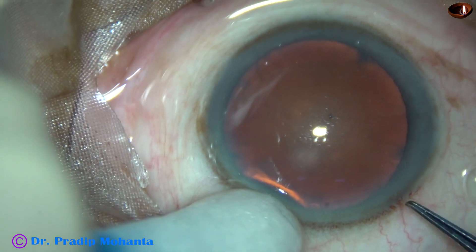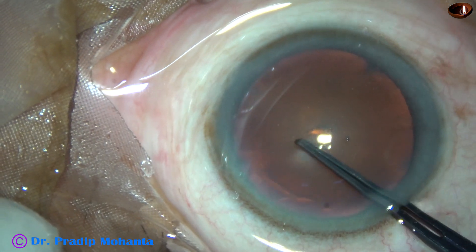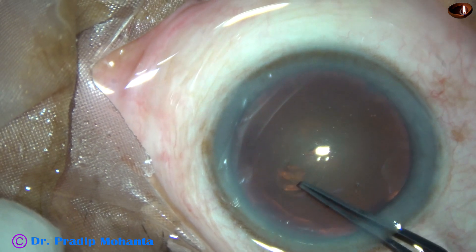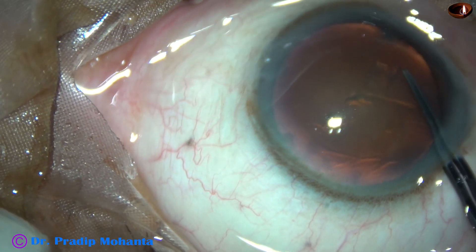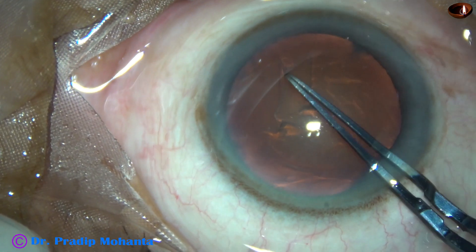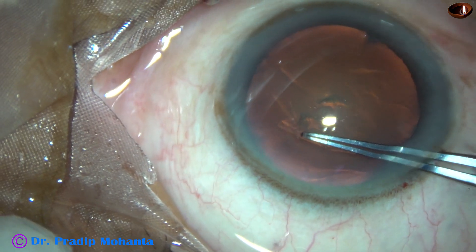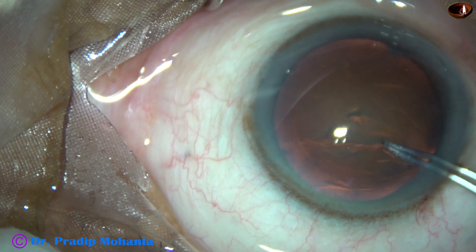Capsulorhexis. We have fairly good red reflex in this case. The capsular tag is raised by the tip of the utrata forceps, and the tag is guided anti-clockwise all around to get an adequately sized rhexis of about 5.5 mm.